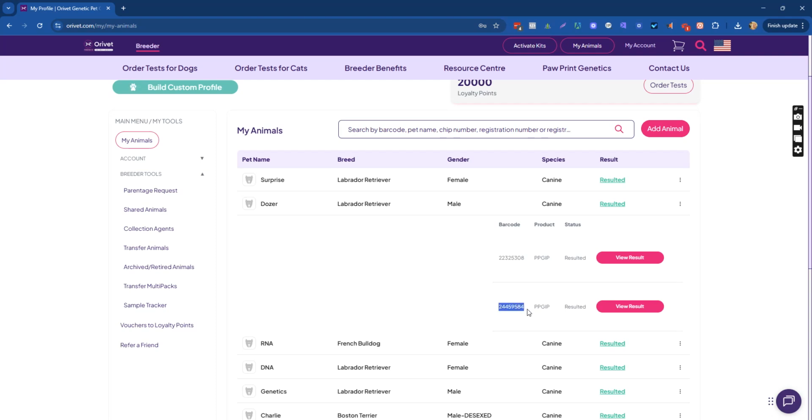The next tab is genetic traits. Similarly, we have 3 columns. The first column tells us the interpretation of the result. The second column is the actual test that was conducted. And the third column is the code for the result. Again, this is just so you can view on screen.